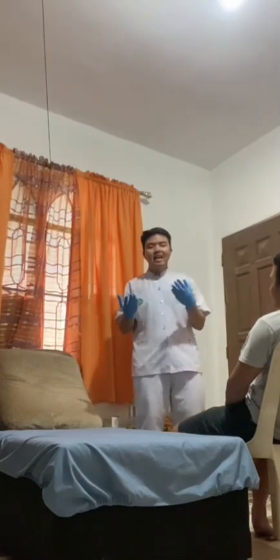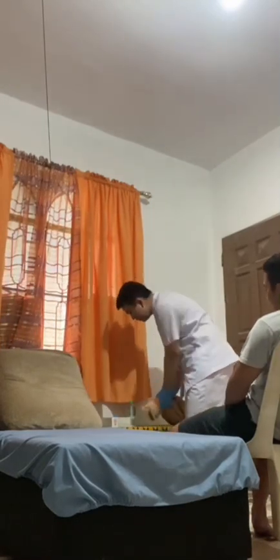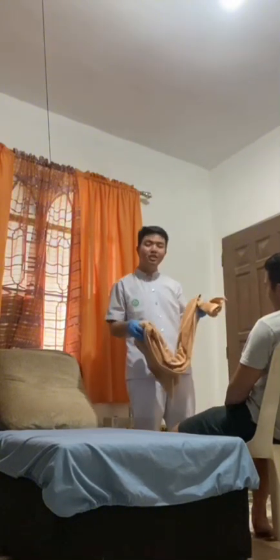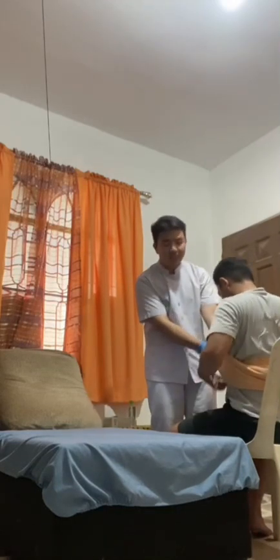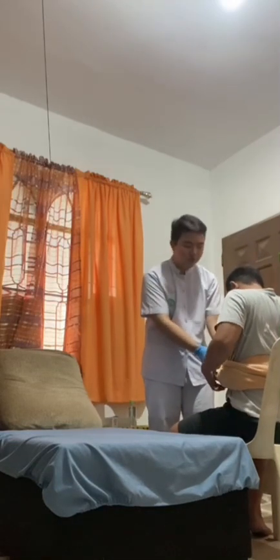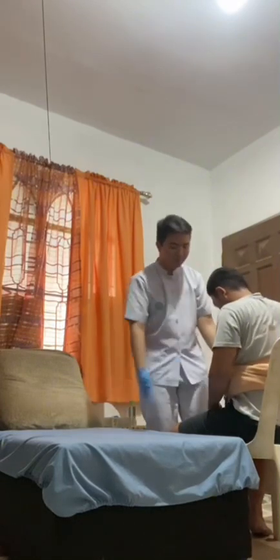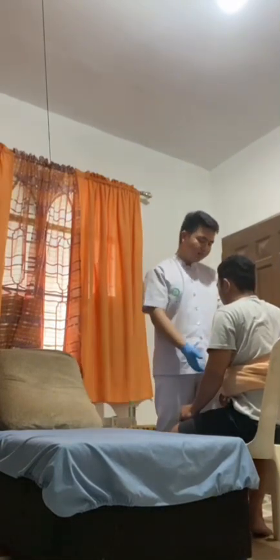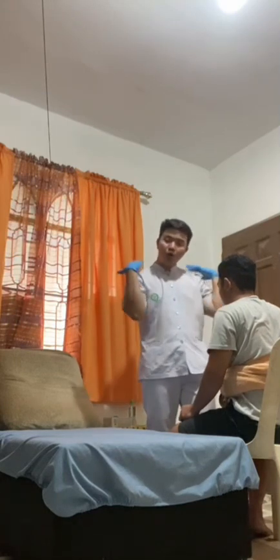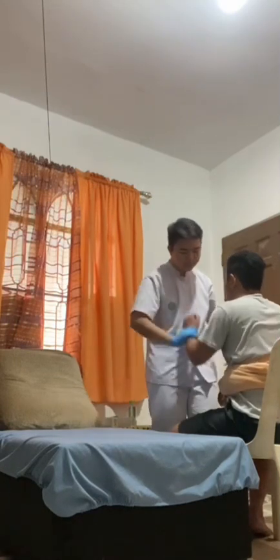And next, I will use the towel and wrap it around the waist of my patient. And make sure that the towel is not too tight and not too loose. And now I'm going to put my legs in between my patient's legs and ask the patient to hold onto my shoulders.